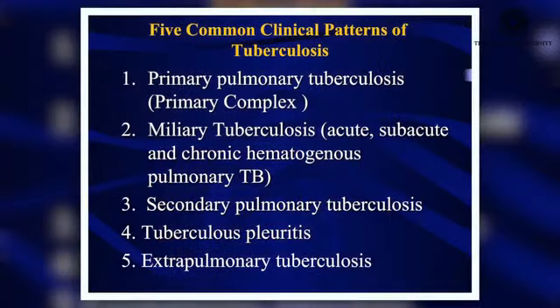So it will be clarified on the images, but for the complete list, primary tuberculosis is usually seen in children, and it's also called a primary complex. Have you heard of these terms which are here? Has anyone heard about primary complex? Okay, so I'll explain it when the image comes. Miliary TB, anyone heard? Okay, so it's good you know one.